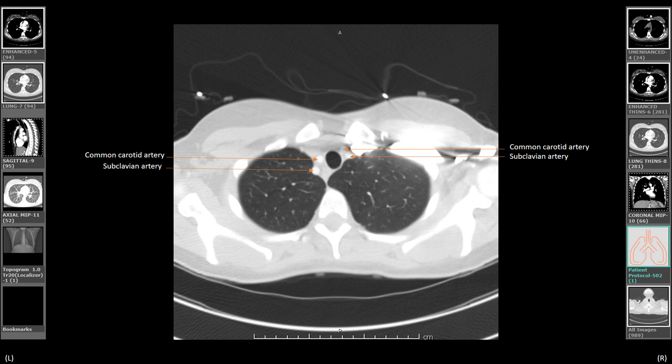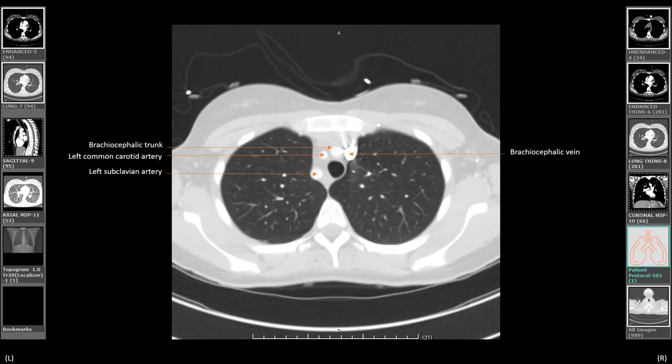As we continue navigating further down, on the right side of the trachea is the common carotid artery and the subclavian artery. On the left side is the left subclavian artery emanating from the aortic arch and the common carotid artery. Here, at the level of the thoracic trachea, when rotating the bronchoscope slowly from left to right, you will face the left subclavian artery emanating from the aortic arch, then the left common carotid artery, followed anteriorly by the brachiocephalic trunk. Slightly to the right, you will face the right brachiocephalic vein which merges with the left brachiocephalic vein and forms the superior vena cava.